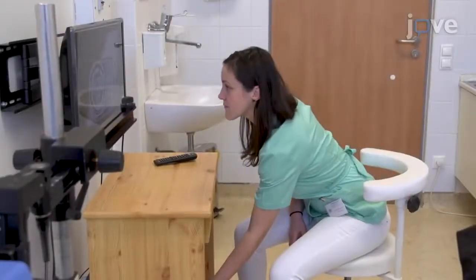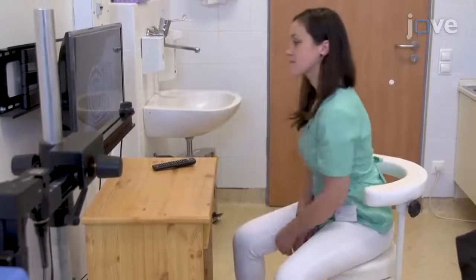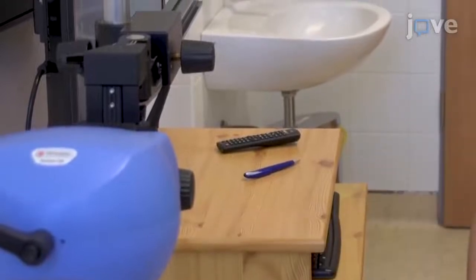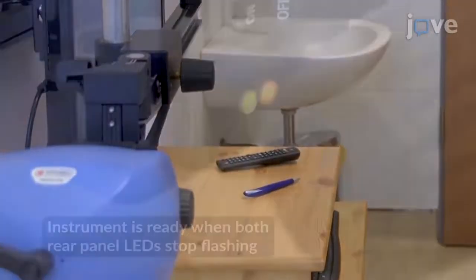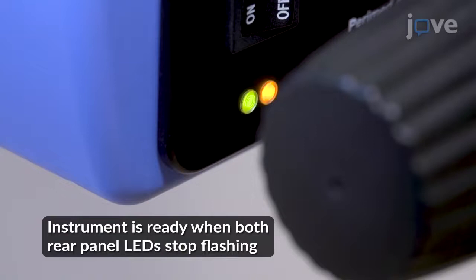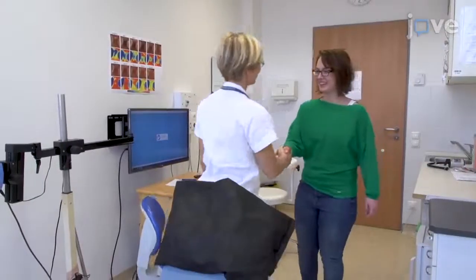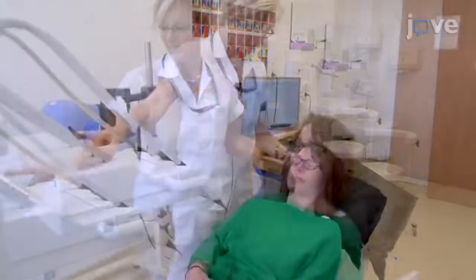For laser speckle contrast imaging setup, switch on the computer and peripherals, and switch on the laser speckle contrast imaging instrument. After the instrument is warmed up for at least 5 minutes, open the software and seat the patient in a comfortable supine position in a dental chair.